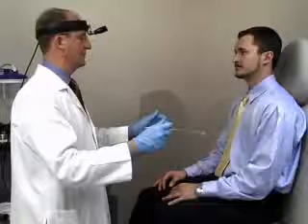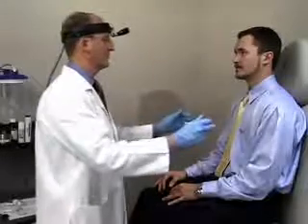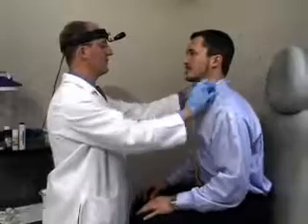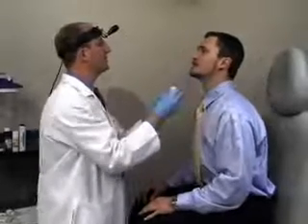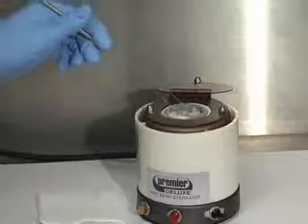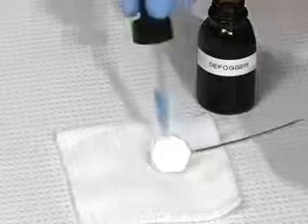The patient should be seated opposite the examiner. Ask the patient to uncross his or her legs and lean gently forward. Ask the patient then to open the mouth widely and protrude the tongue. Warm the mirror to just above body temperature, or coat the mirror with an anti-fogging solution.